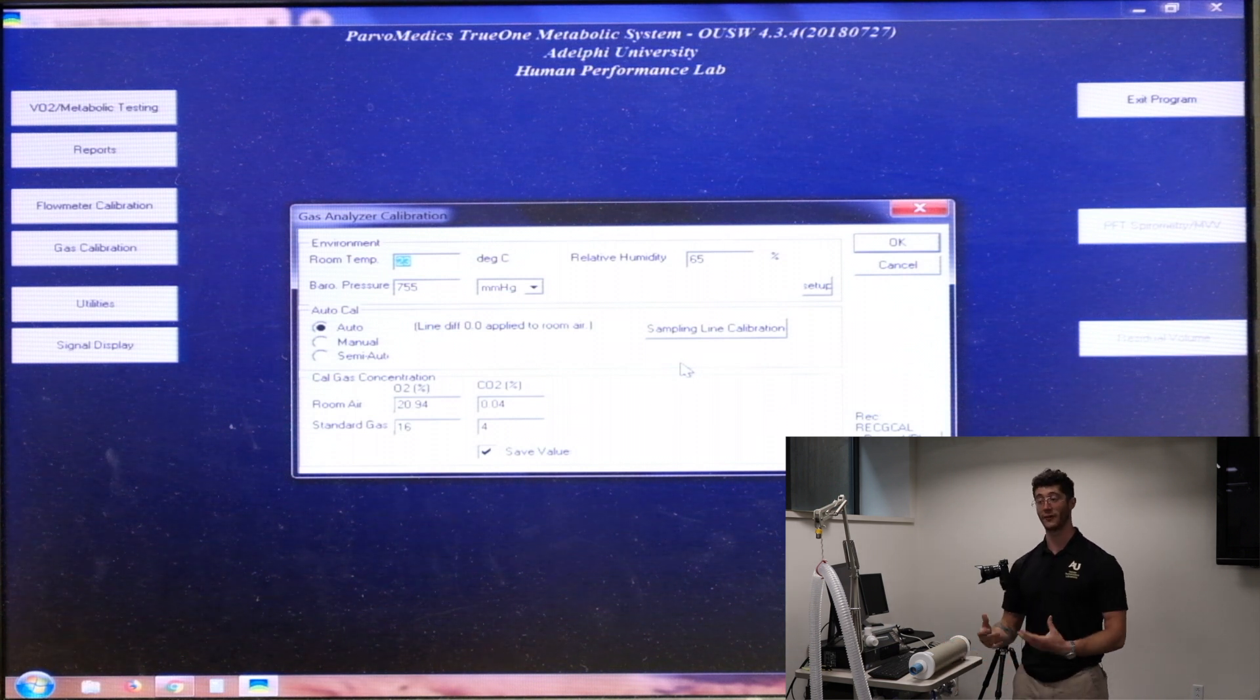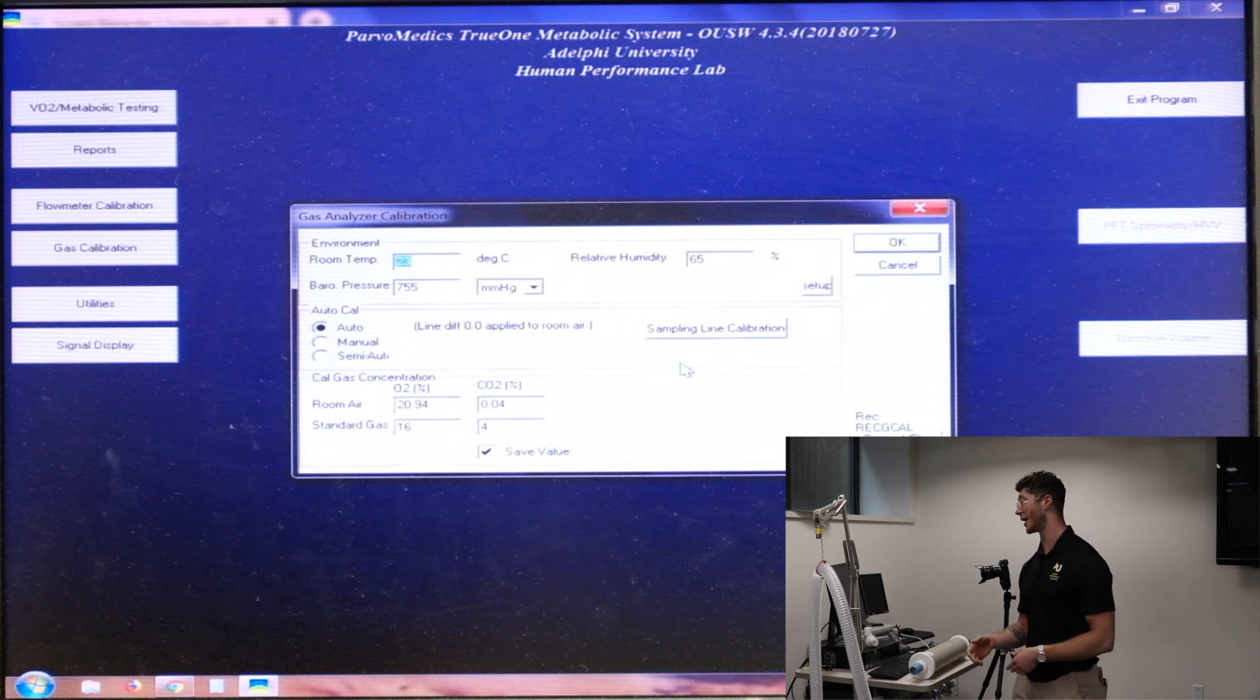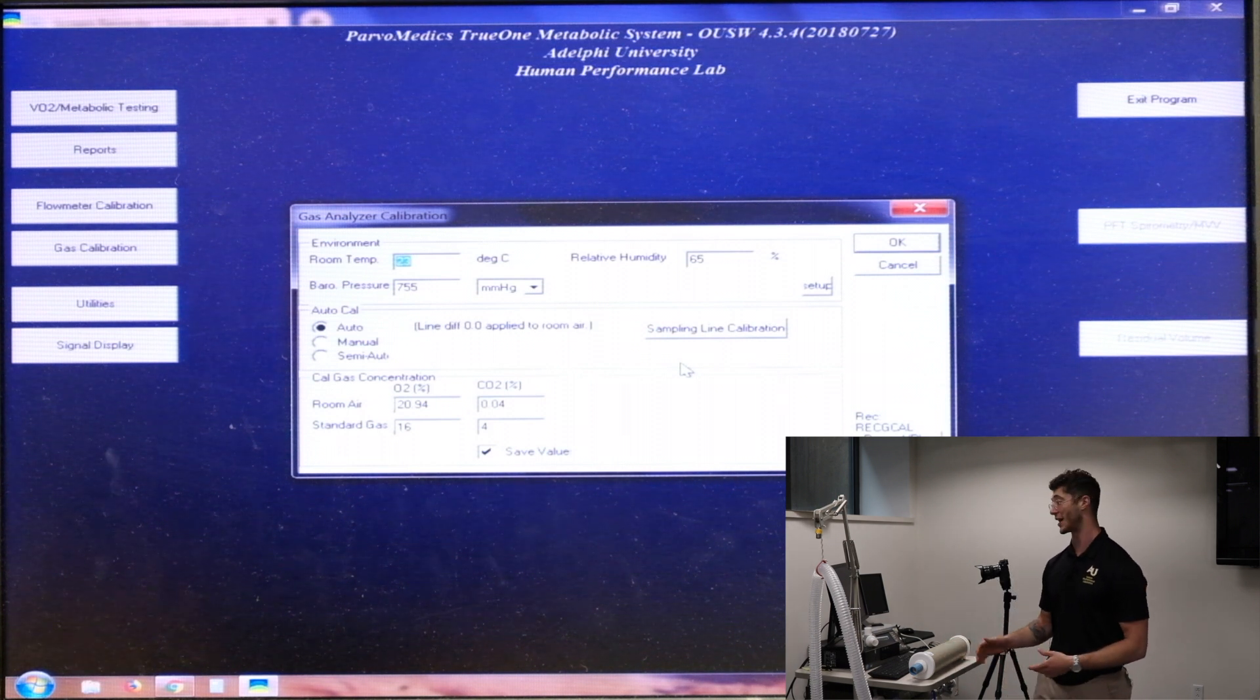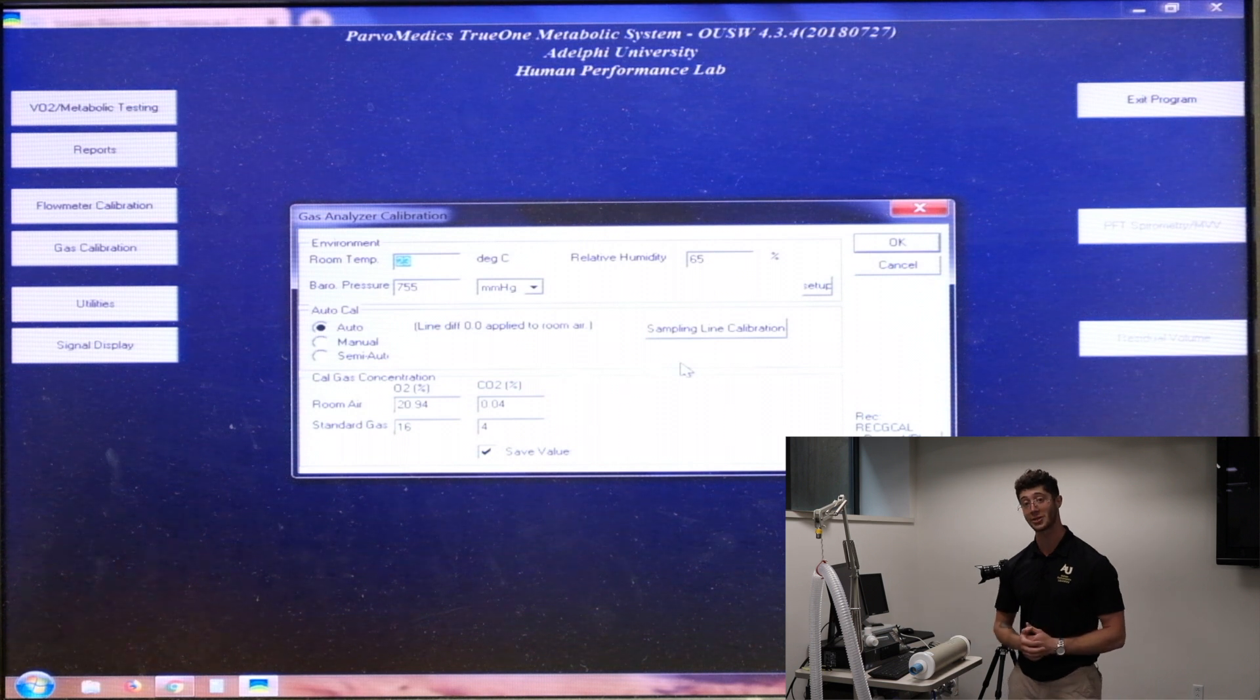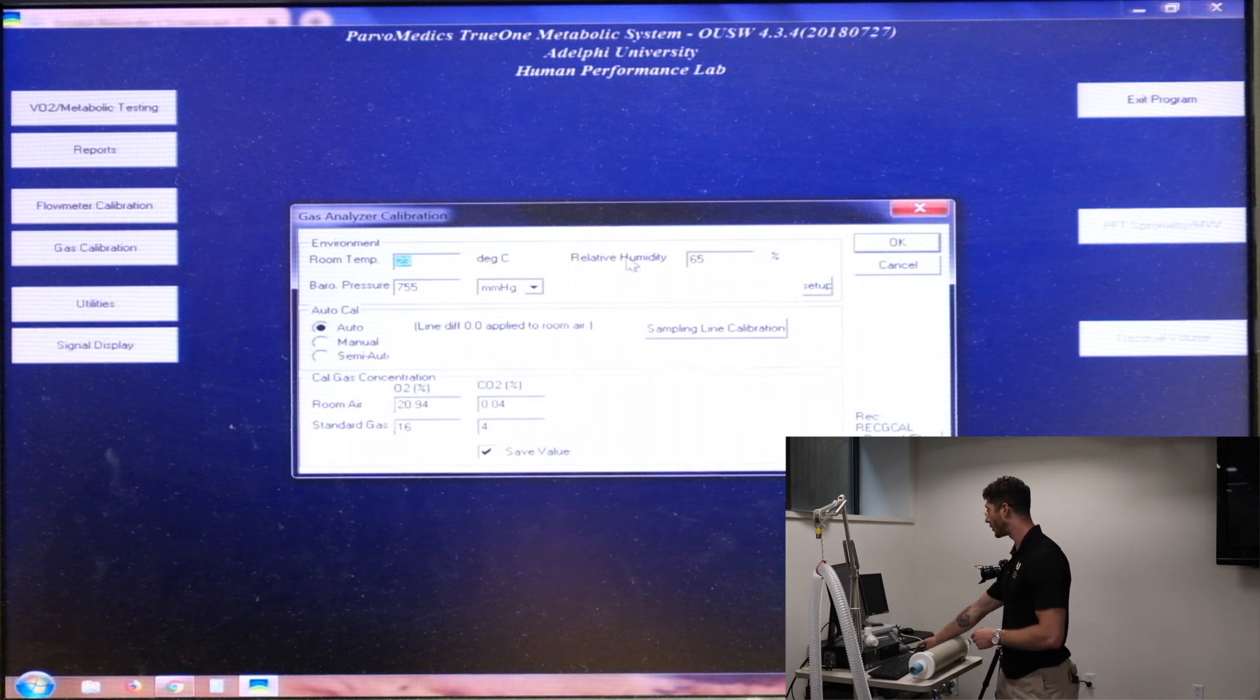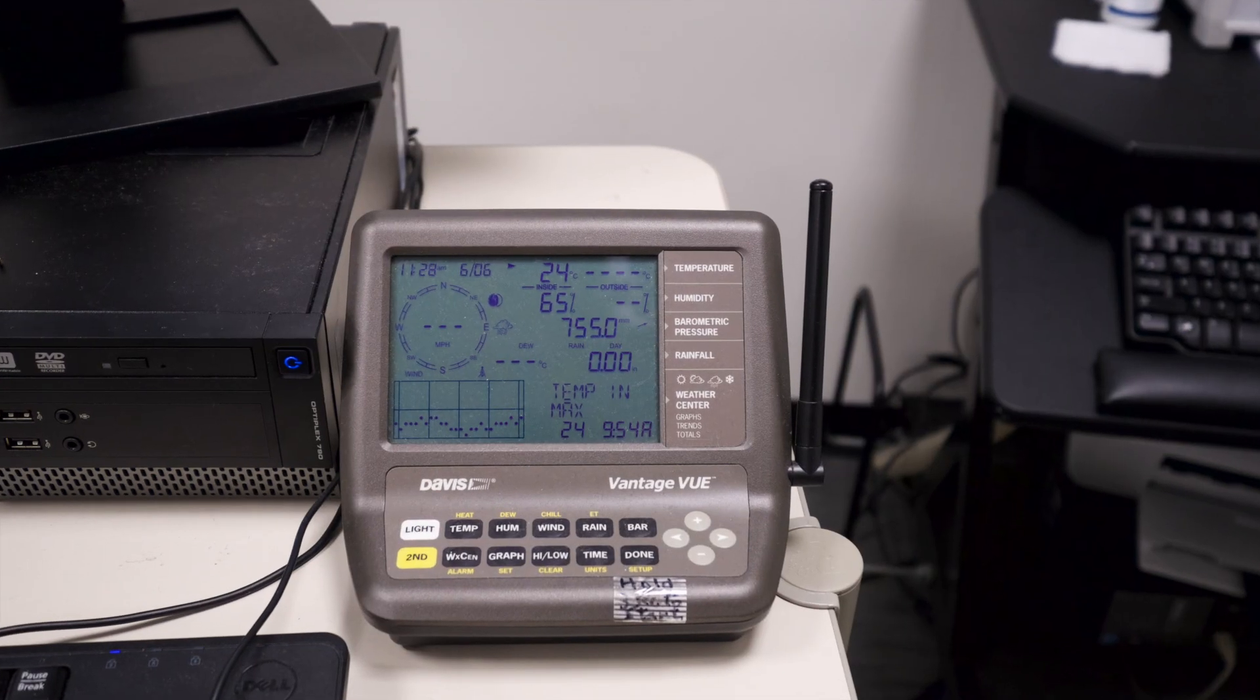So if it measures 16.05 and 3.95 of oxygen and carbon dioxide respectively, we know that there needs to be some sort of percent change. So you'll see that when we finish our gas calibration. But for now we're going to say that room air at sea level is supposed to be 20.94% oxygen and 0.04% carbon dioxide and the standard gases as I stated before. So we can go ahead and adjust any of those environmental variables. They actually all seem to be correct based on our weather station over here. So we can get started.